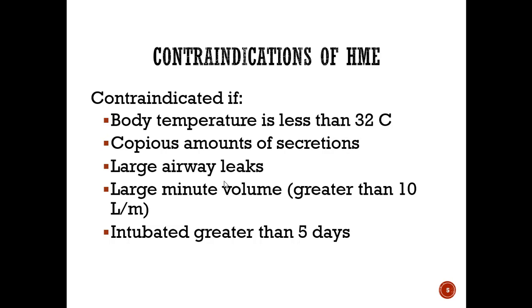The other thing is we know that temperature has the greatest influence on humidity. So if you have a colder core temperature, your ability to humidify is going to be compromised already because cold air does not hold as much moisture, okay? So that's two reasons why if your core temp is lower than 32 degrees Celsius, you cannot use an HME. So if there's any mention in a patient case scenario of hypothermia, just know that it has to be that active heat and humidity, which is your passover humidifiers.